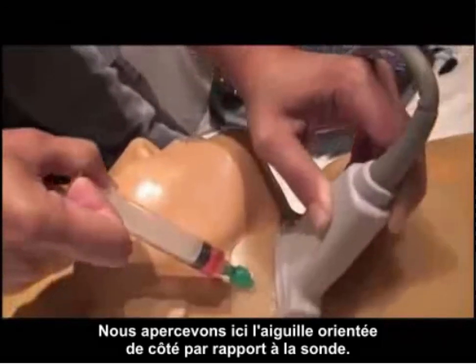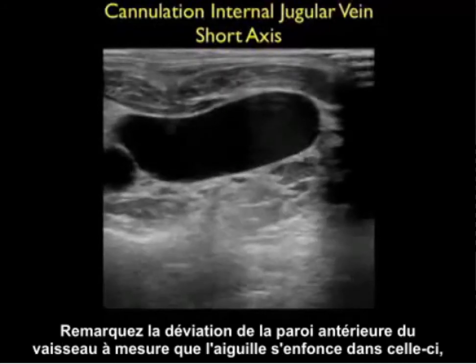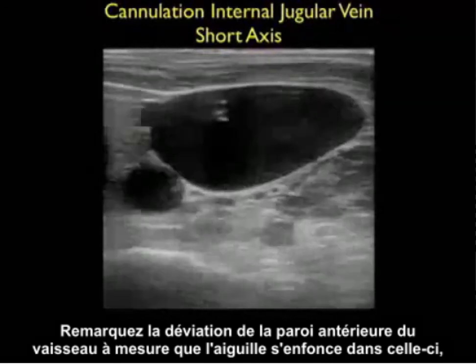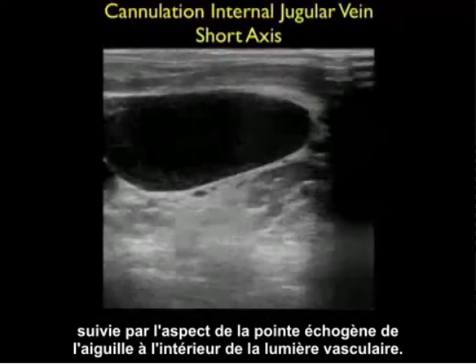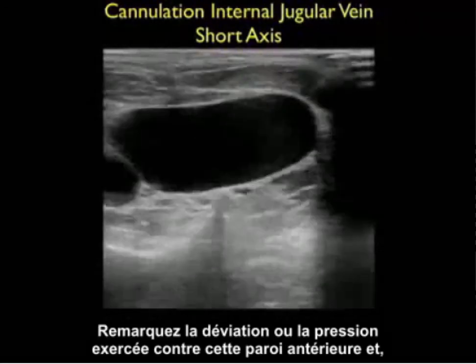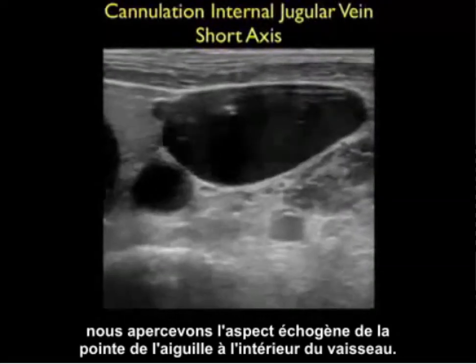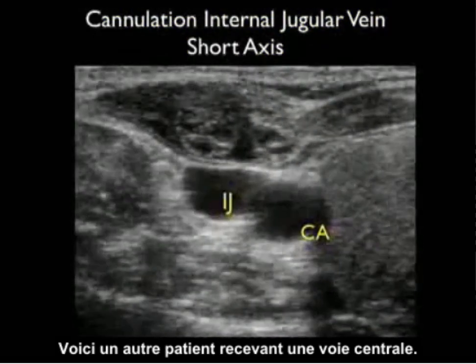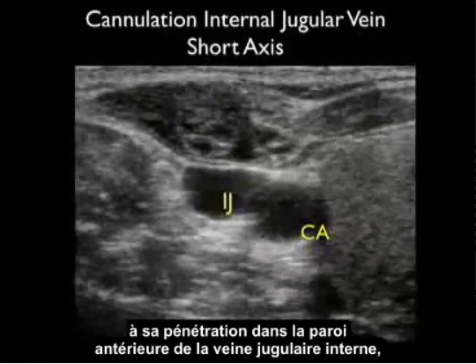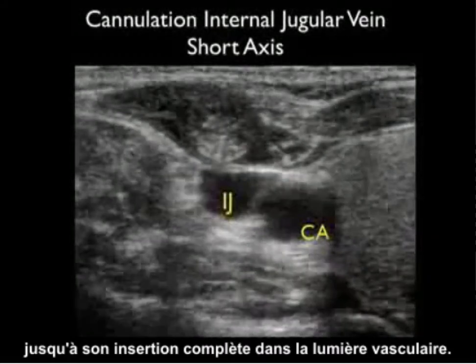Here we see a side orientation of the needle with regard to the probe. Here's an actual cannulation of an internal jugular vein. Notice that we see the deflection of the anterior wall of the vessel as the needle pushes down on that wall, followed by the appearance of the echogenic tip of the needle within the lumen of the vessel. Notice the deflection or pushing down of that anterior wall, and then as the needle permeates that anterior wall we see the appearance of the echogenic tip of the needle within the vessel. Here's a different patient receiving a central line — we can actually visualize the echogenic needle coming from the surface and going all the way down through that anterior wall of the internal jugular vein to park directly into the lumen of the vessel.